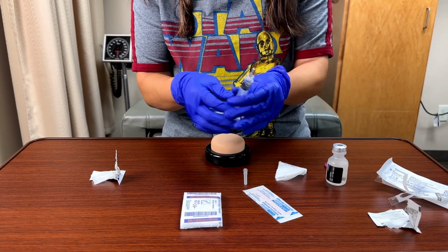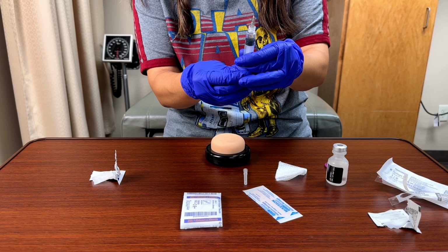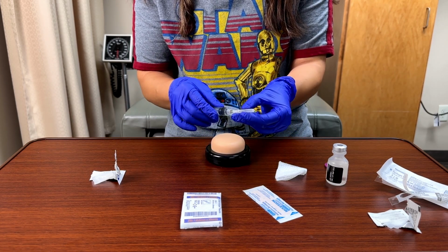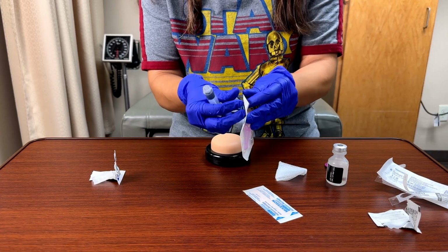Okay, once I do that, I'm going to get my air bubbles out. Very good, and I'm going to prep it, make sure that that air bubble is up and out of the hub. And then I'm going to be careful to recap this and take my drawing needle off. Now I'm going to replace it with my injecting needle.